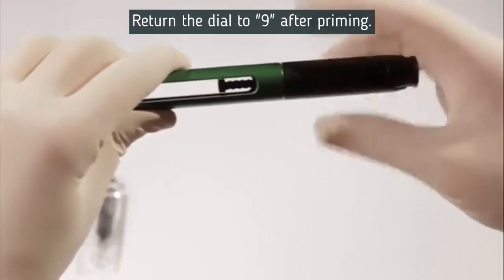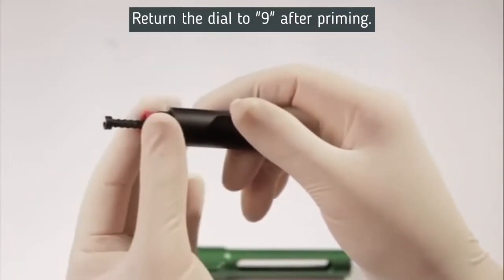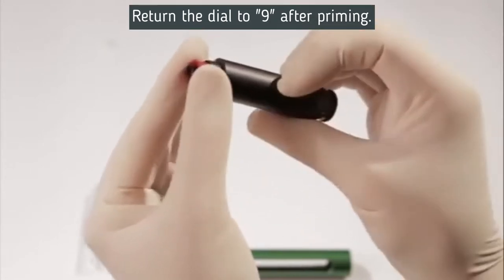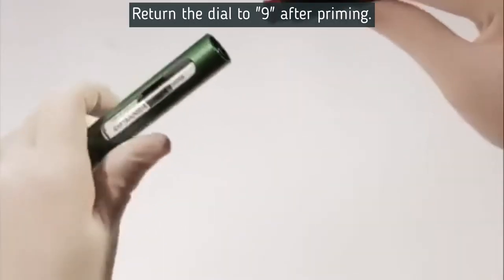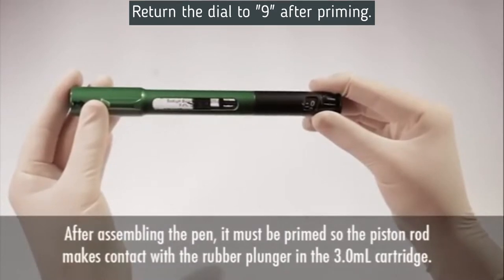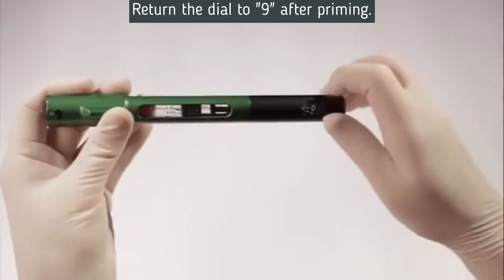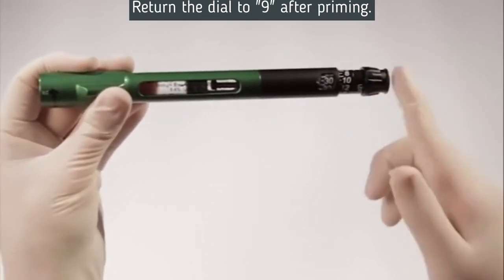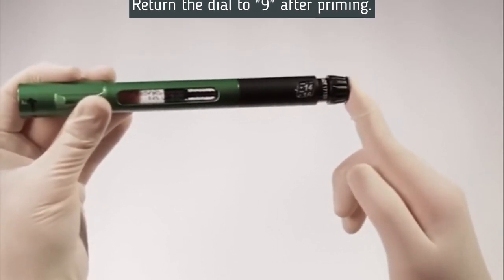Prior to loading each new 3-milliliter cartridge into the pen, unscrew the body from the chamber and check to see if the internal piston is fully retracted. If it's not fully retracted, grip the red reset mechanism with your thumb and forefinger and rotate the pen counterclockwise until the piston rod is fully retracted and stops. Then insert a 3-milliliter cartridge into the small end of the pen's chamber with the septum entering first, and screw the pen back together. After loading, prime the pen by turning the volume dial to any number and gently pushing the dispensing button until you feel the piston rod make contact with the rubber plunger. You'll know contact is made when the dispensing button stops before reaching zero.